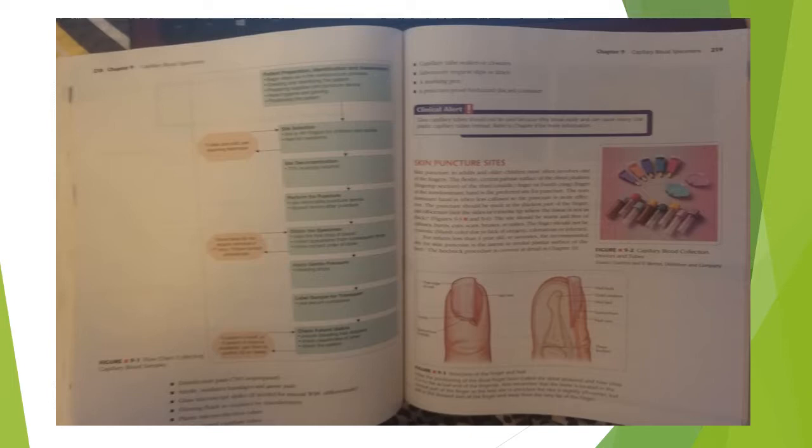Skin puncture sites. Skin puncture in adults and older children most often involves one of the fingers. The fleshy central palmar surface of the distal phalanx fingertip section of the third middle finger or fourth ring finger of the non-dominant hand is the preferred site for puncture. The non-dominant hand is often less callous, so the puncture is more effective.